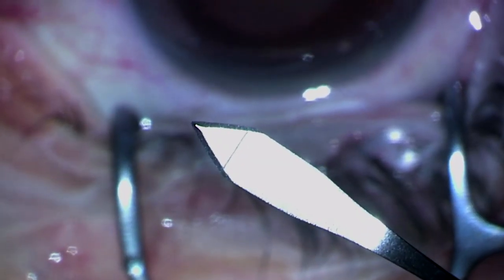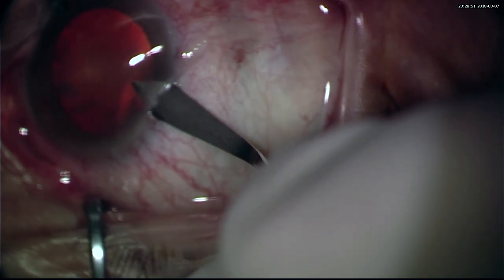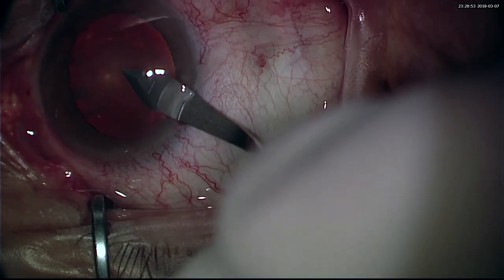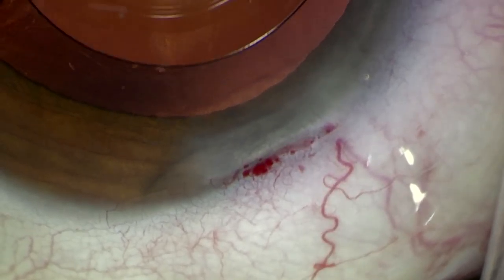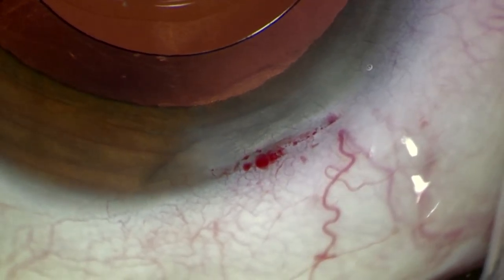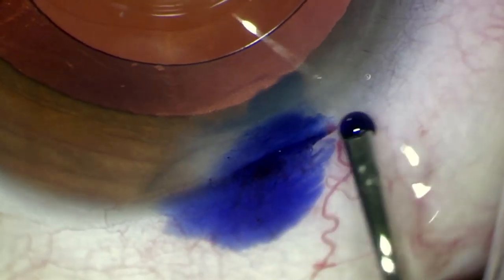Incisions for cataract surgery have constantly evolved. From mounted blades to laser sculpted microsurgical blades, the approach to incisions for phacoemulsification has changed. With a decrease in size and the surgical site moving from the sclera to the cornea, concerns regarding patency and sealing have led to the development of new materials and designs for incisions in manual surgery.